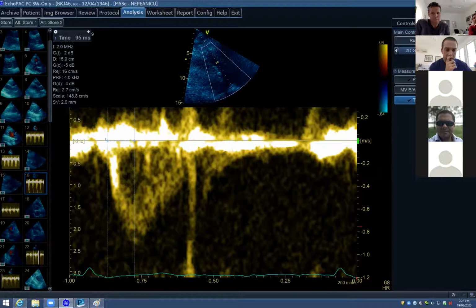Because based on what we saw last time with the tricuspid Vmax, say it was around about 3, that would give us peak pressures of 3 squared times 4, the modified Bernoulli equation. So 3 squared is 9, 9 times 4, added on right atrial pressure, which, let's say we got an IVC that's dilated, so we'll give it sort of 8 to 10. So we're looking at systolic pulmonary pressures of around 45, 50-ish maybe. So that's kind of in the moderate ballpark.